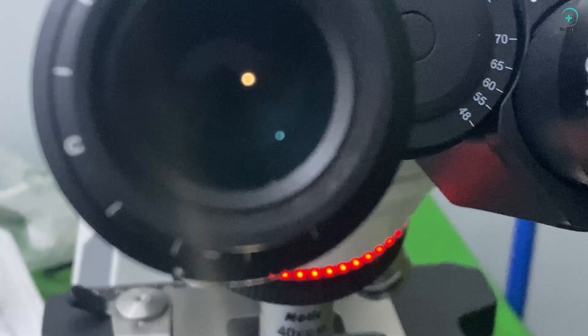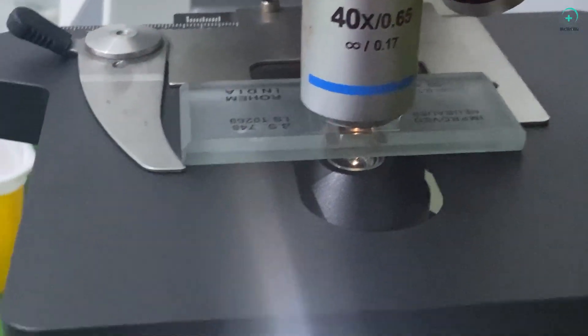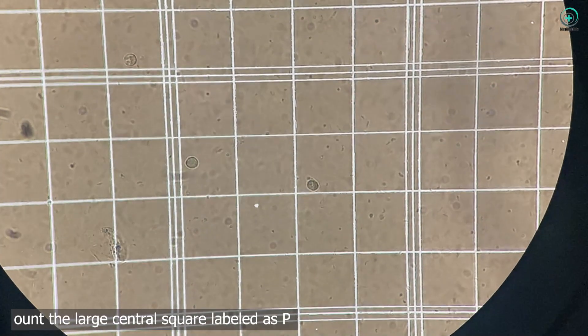Step 6: Platelet counting. Time to count the platelets. Under a microscope, we focus on the central square labeled P.